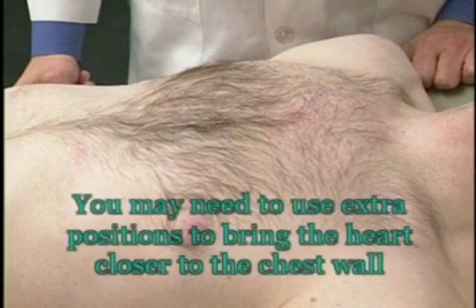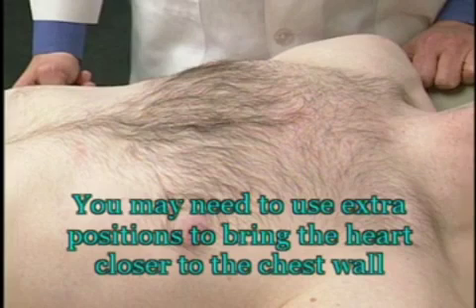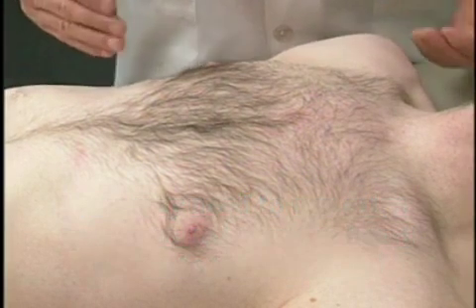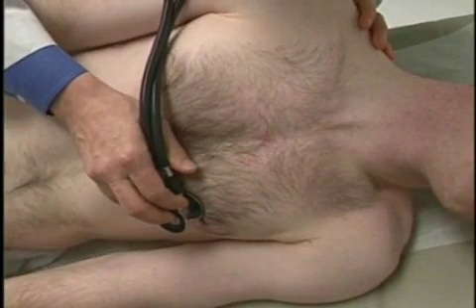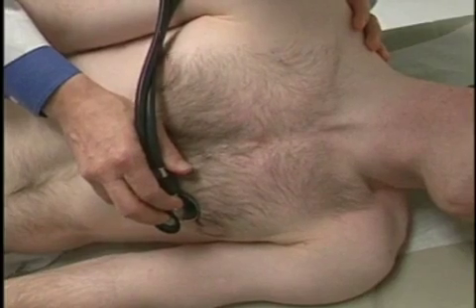Sometimes you need to do extra maneuvers or positions to bring the heart closer to the chest wall. You may ask the patient to roll on their left side. In fact, you could roll over on the left, about 45 degrees. Exhale completely. Again, this maneuver brings the heart closer to the chest wall and aids in auscultation. You can breathe.